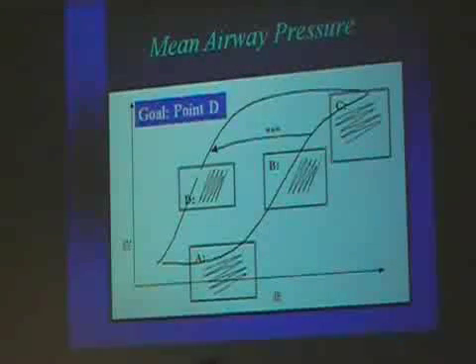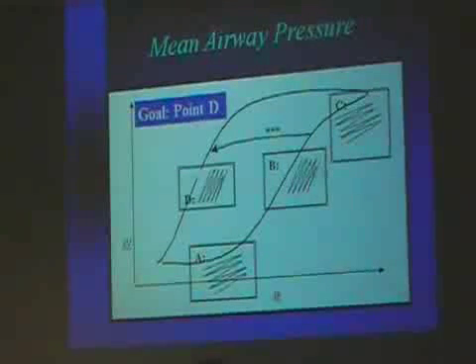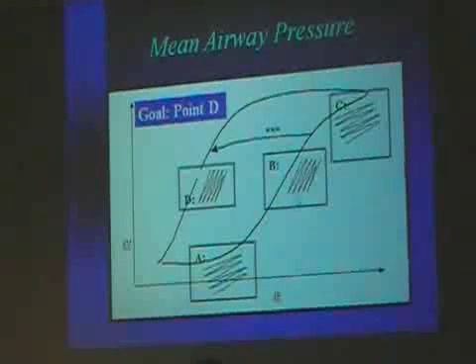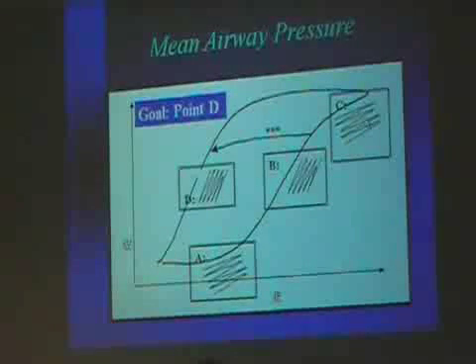All right. As you go up with more pressure, and the lung is opening, like the balloon that you're blowing on, and it starts to expand, then you get a nice compliance. All right, well, look, this looks the same. Gee, why is that? Well, because as you go up the pressure volume curve and you start getting a little bit over-distended, what happens? Your compliance goes back down again. That's because you're slightly over-distending the lung.